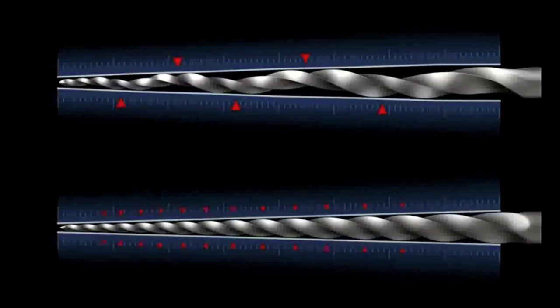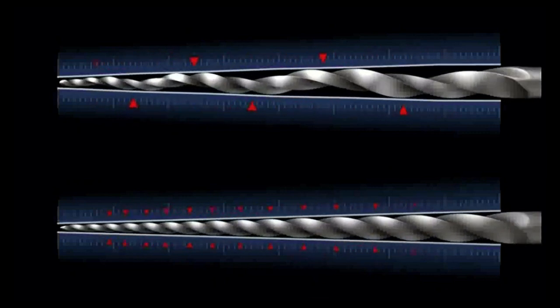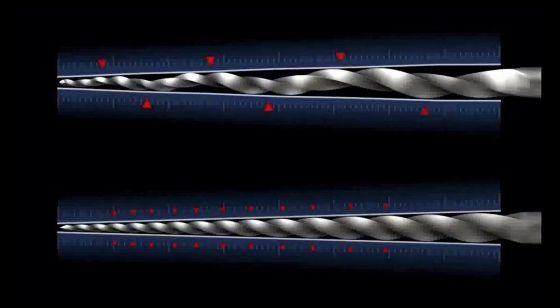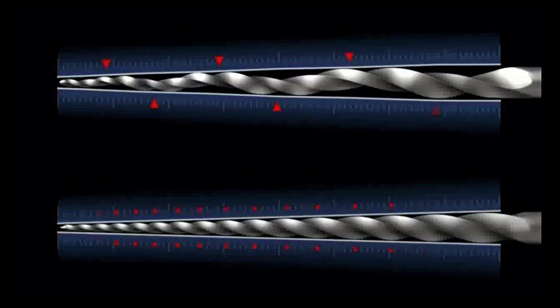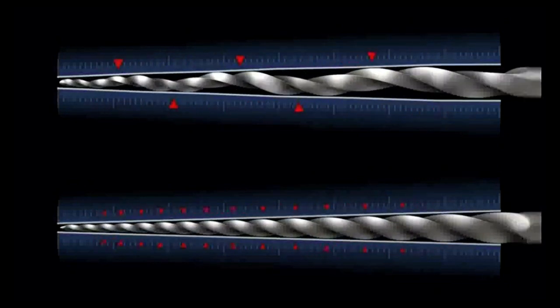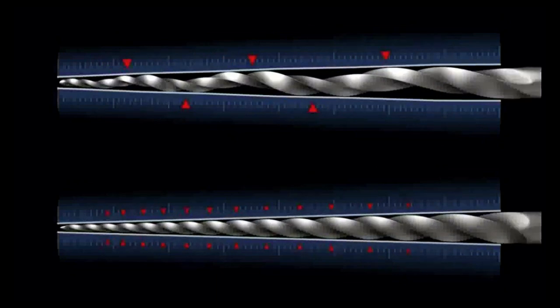So that would be a very specific progressive shaping like Schilder taught us many years ago. We're choosing to shape the canal where we want, as opposed to the instrument telling us. And also, again, we're making bigger spaces for removal of dentin, which we need to remove to allow us to fit the cone.